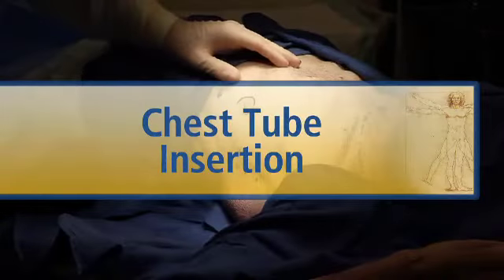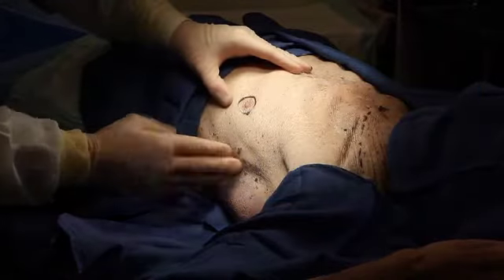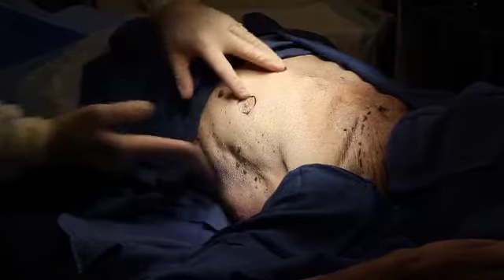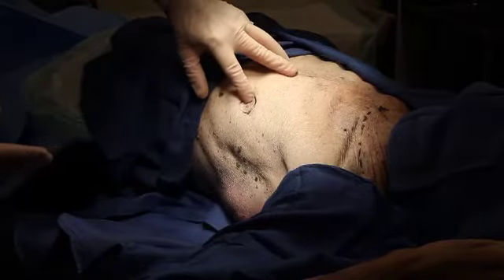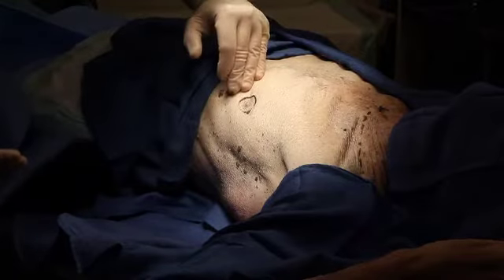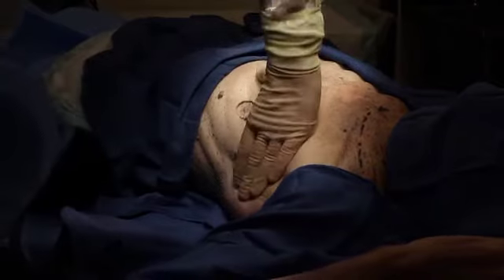The site most often used for chest tube placement is the fifth intercostal space just anterior to the mid-axillary line on the affected side. External landmarks for this site include the nipple level in males, the inframammary crease in females, or the width of the operator's hand placed in the patient's axilla.